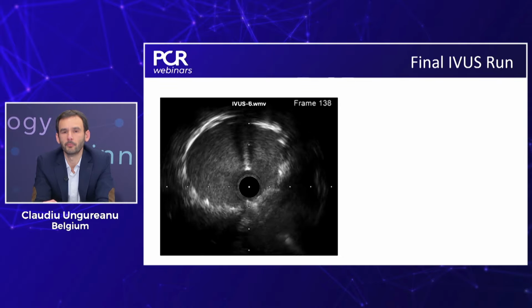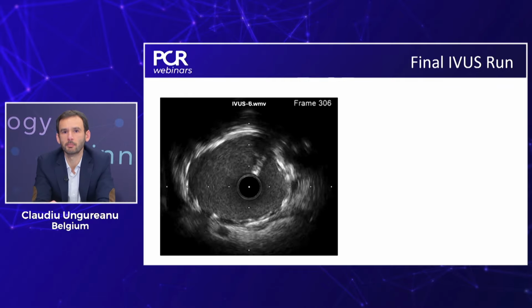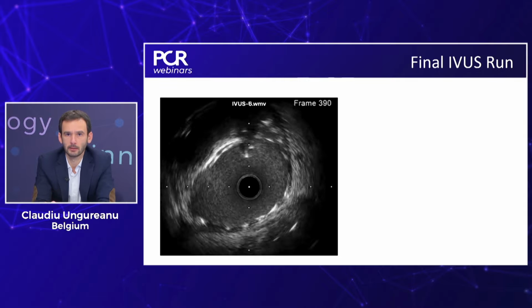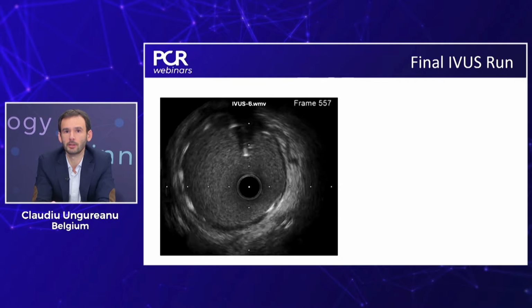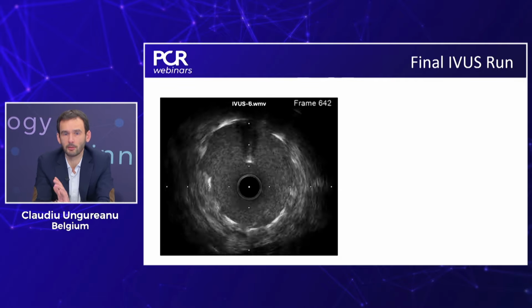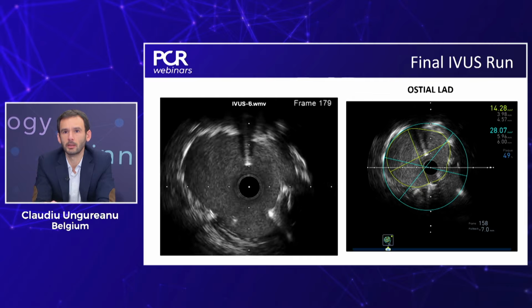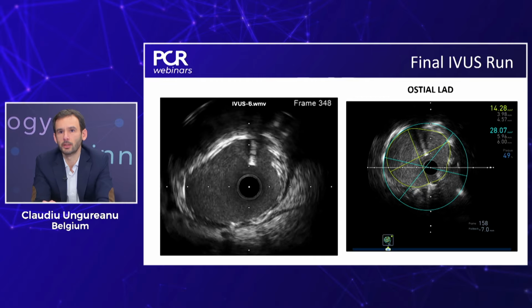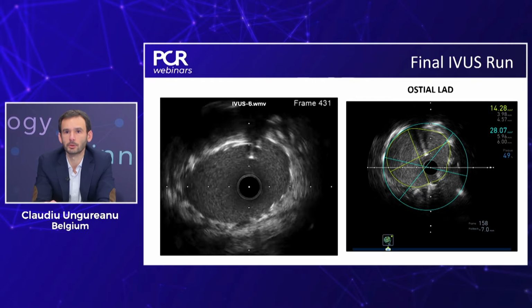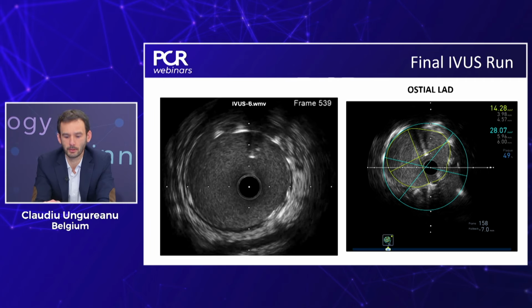And we didn't see under-expansion zones. The stent was really nicely expanded, like nicely apposed also, and not completely circular for sure. We didn't expect that even after treating extensively the calcified lesion with rota, IVL and non-compliant balloon and high pressure. But it's pretty nice, and we had a decent minimal stent area. We know that is the most important trigger to define outcome for the patient. And 14.28, I think it's a good minimal stent area at that level.